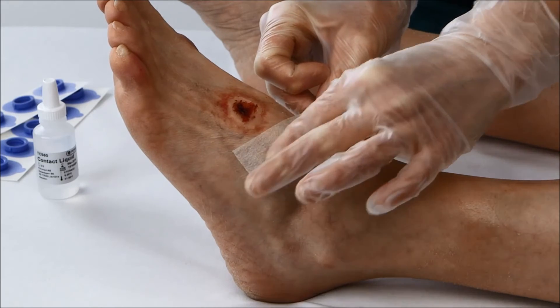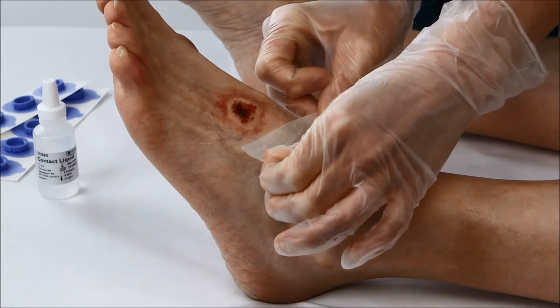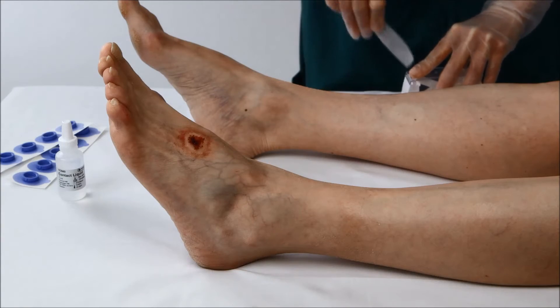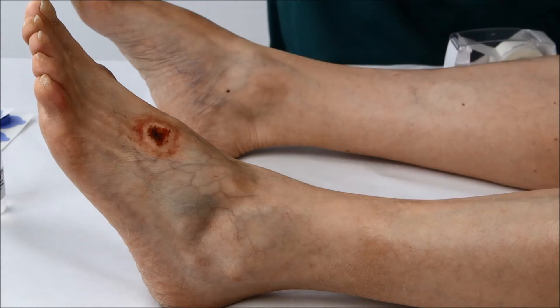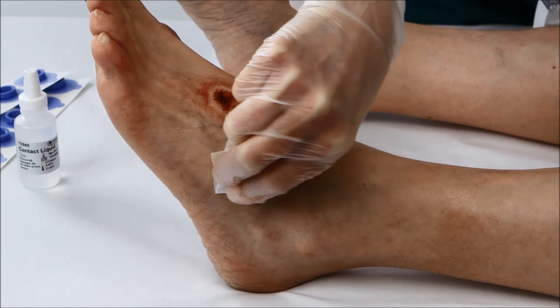To ensure an airtight seal, remove hair at the chosen sites. Then blot with medical tape, such as TransPore, to remove dry skin. Change and repeat until the tape appears clean. Finally, wipe with alcohol to make sure all creams and oils are removed.